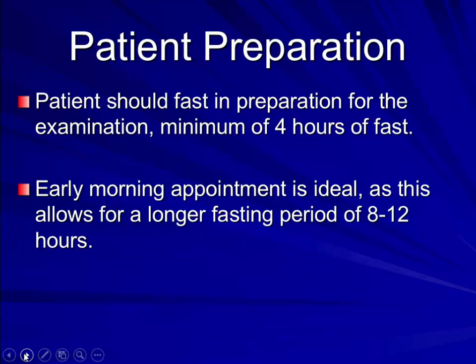In terms of patient preparation, a minimum of 4 hours of fasting is recommended. Early morning appointments are ideal as they allow for a longer fasting period of 8 to 12 hours.